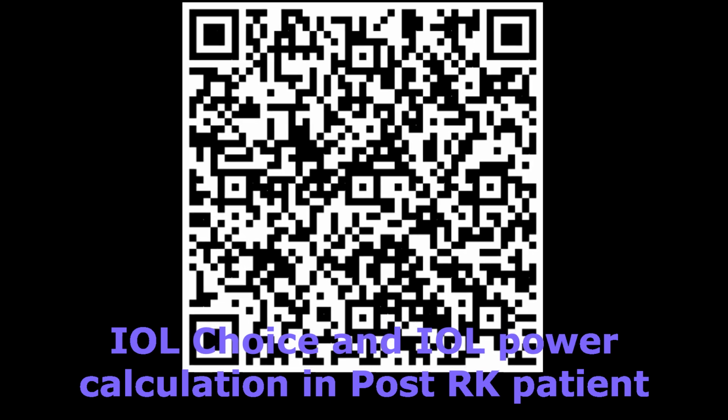The issue with these patients is discussed very well in this panel discussion which is available on internet, and this is the QR code, one can scan and visit that. I'll just highlight few salient issues associated with the radial keratotomy patients.